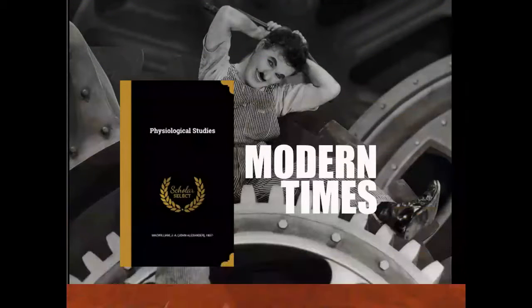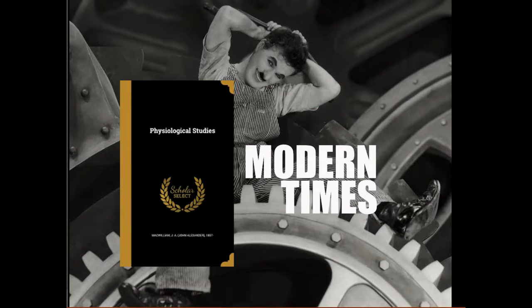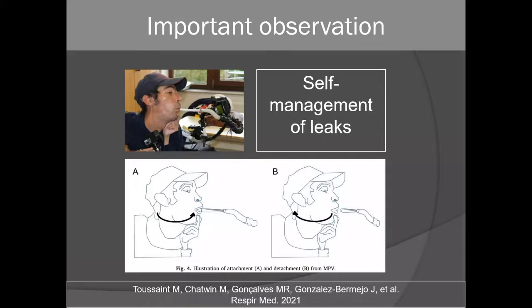After this period of prehistory, we had some more physiological studies. These were the modern times of mouthpiece ventilation. In this modern time, the most important observation is that patients are managing their leaks by themselves. When they want to have air, they just purse the lips. When they do not want air, they just disconnect and release the mouthpiece. This is extremely important to understand. Now I will show you this.